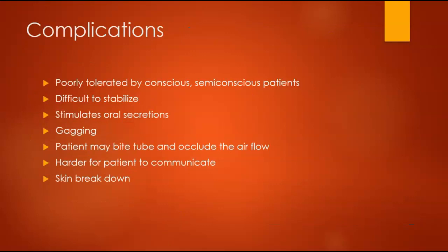Okay, all right, some complications associated with intubation. If your patient's conscious or semi-conscious, they're not going to tolerate this well. You wouldn't either. If somebody sticks a laryngoscope blade in the back of your throat when you're awake, you are going to vomit. So you need to make sure the patient's completely sedated.